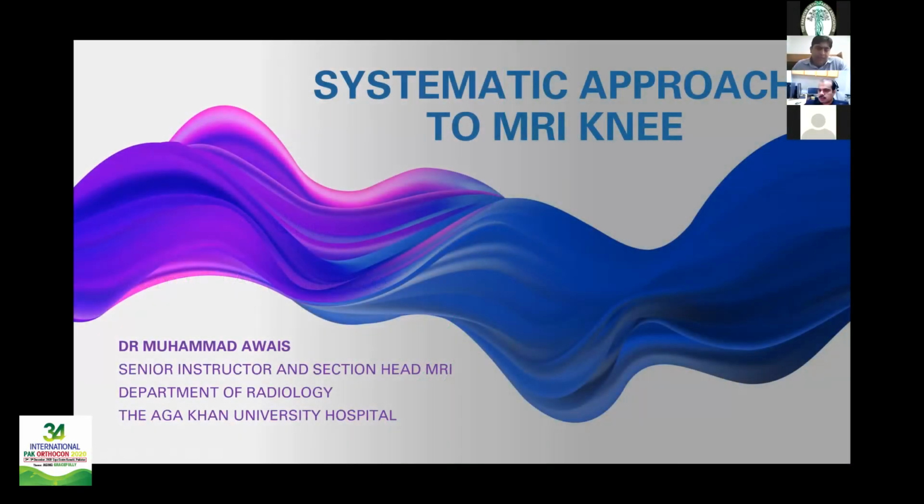Assalamu alaikum, and thank you to the Orthocon team for giving us this opportunity to present. I will be first talking about the systematic approach to MRI in knee. Later, Dr. Amin will be presenting a small talk on MRI of the menisci, and followed by that, I would be presenting MRI of the articular cartilage.